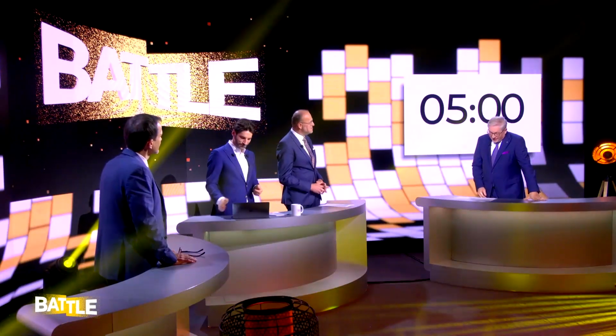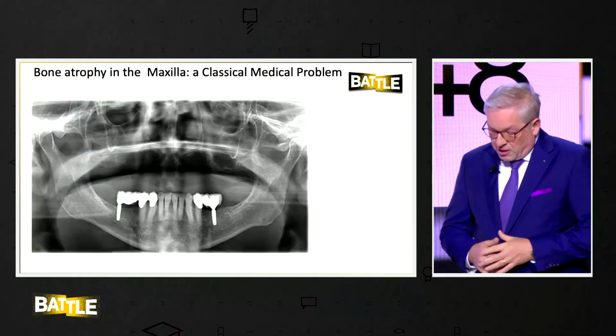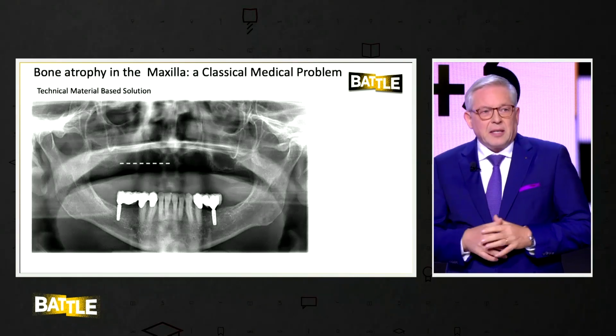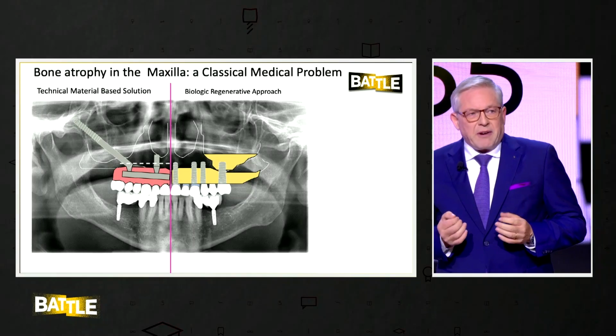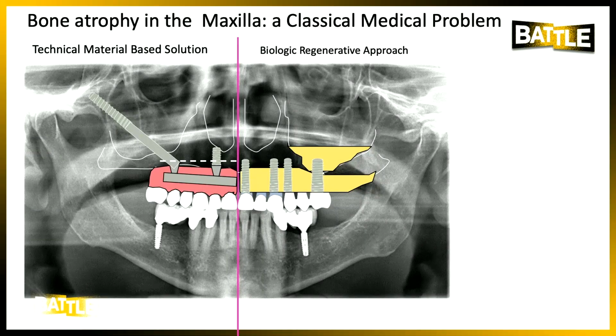Thank you, Gerrit. Let me tell it like this. Alveolar bone and fixed gingival tissues are tooth-dependent tissues, and they fade away once the teeth are gone. But my point is, this is not irreversible. In an atrophic maxilla, we can resect a little bone to create room for a bulky, cantilevered prosthesis, a very stable one, but we also, in contrast to this, have a biologic regenerative protocol where we preserve the tissues and integrate tiny, delicate prostheses.